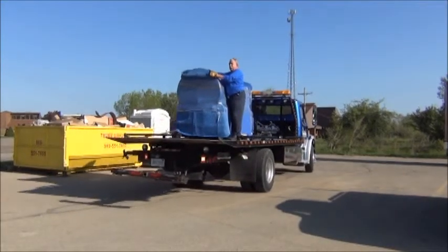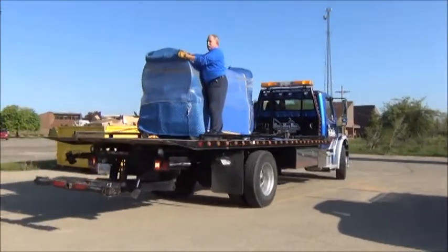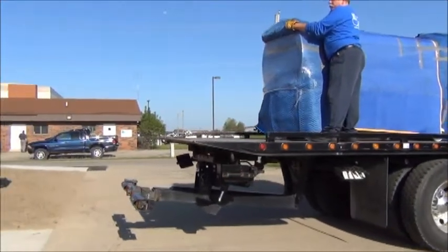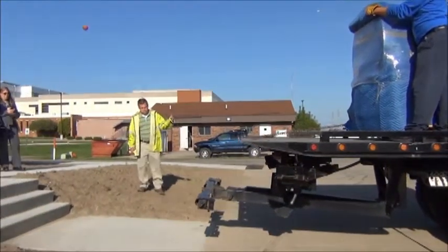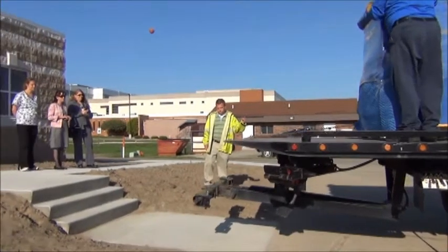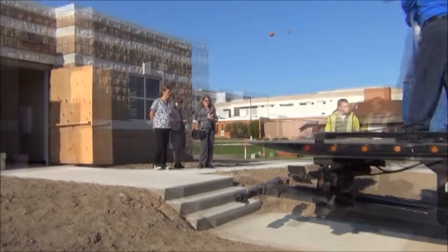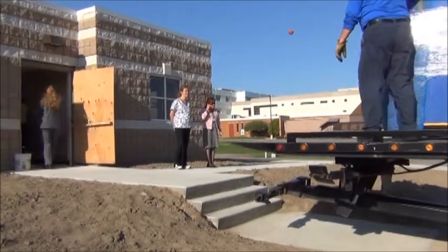Jenny Anderson likened it to diving. When you get in the chamber, we pressurize you so that it's like you're going undersea, and as you go deeper, the pressure gets greater, and we're feeding 100% oxygen into the chamber, so that oxygen perfuses throughout the body more so than at land level.